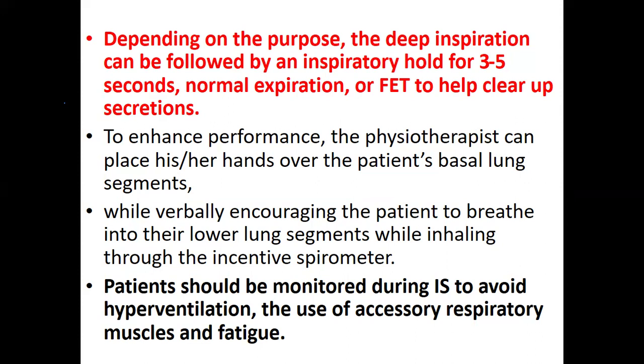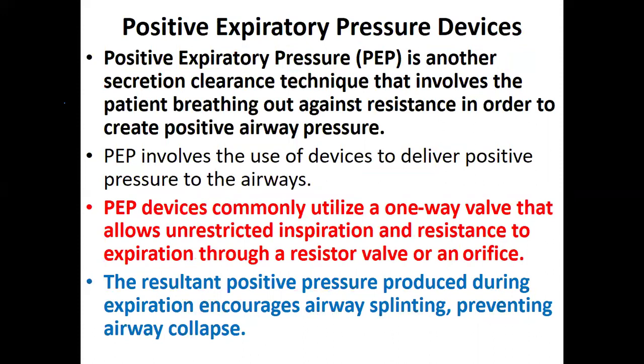So if what you want to achieve is airway clearance, they can breathe in, push up the balls or the volume as high as they can, then when breathing out, you add a forced expiratory technique, or they cough at the end of it. Patients should be monitored during this technique to avoid hyperventilation and use of accessory muscles leading to fatigue.